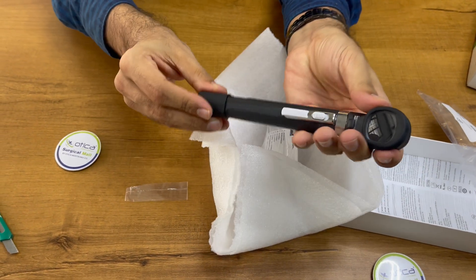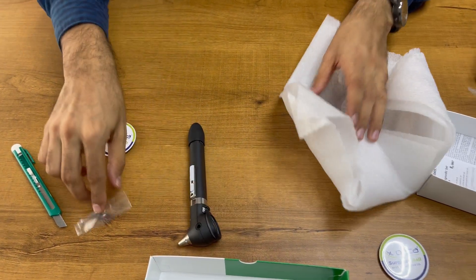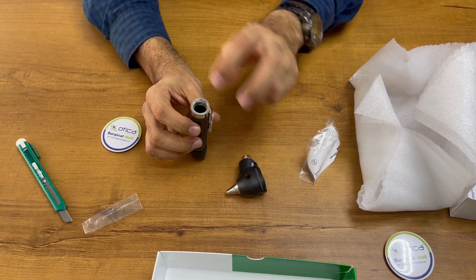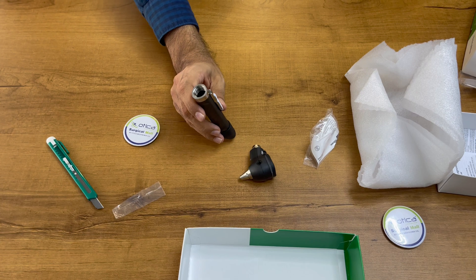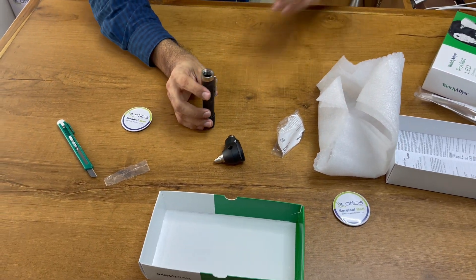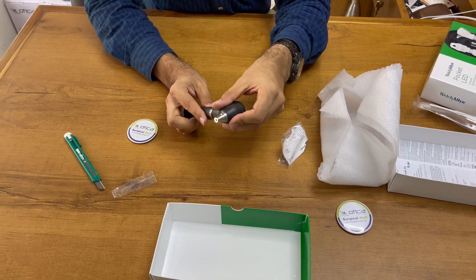The tail bumper is there, so you need to attach this. The otoscope is now ready to use. You just need to insert two pencil cell batteries inside so the device will start working. We are putting two batteries inside — you can see one plus will be on the upper side.